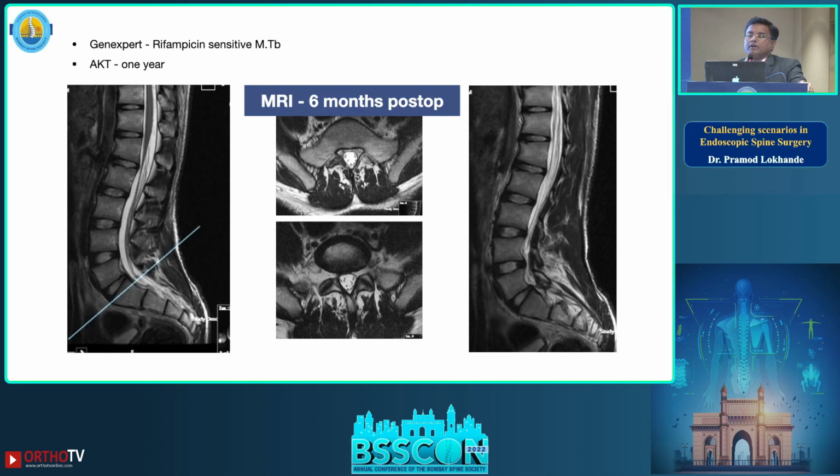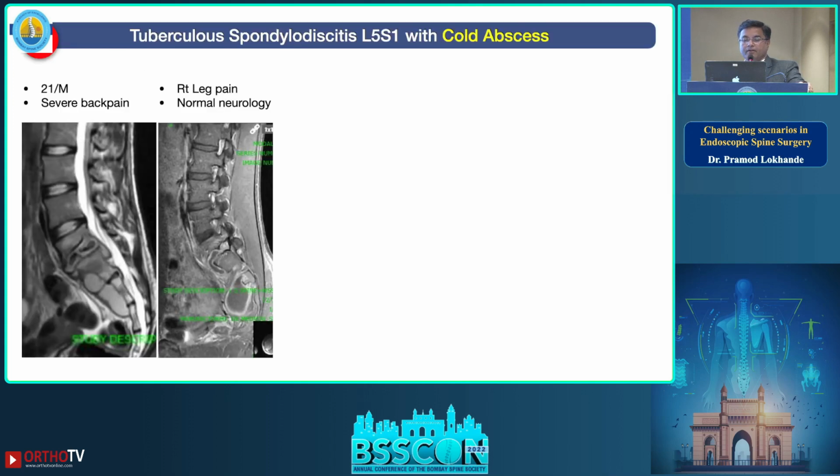And these are the post-operative MRI pictures. You can see there is complete resolution of the abscess and you don't see any evidence of any surgery anywhere.